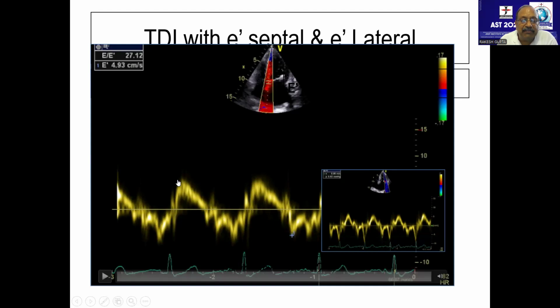Then came opening of the aortic valve leaflets, and this is a true systole. Now the aortic valve is closed, and the mitral valve has not opened up. This is isovolumic relaxation time. Now suddenly the mitral valve opens. The first initial emptying, which in tissue Doppler is known as E prime. Then comes diastasis, and then comes the atrial kick.